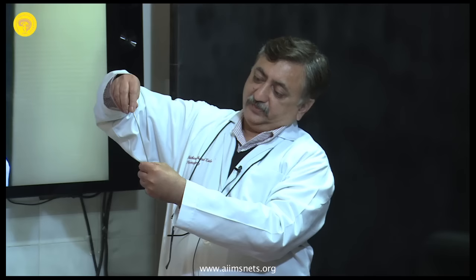That's the joint. So even if you don't distract it, because it's difficult to distract, what you can do is drill away some part of the facet here. The moment you drill a little bit, or even nibble it away with an upcutting instrument, you'll be able to see the joint, you'll be able to see the facet below. And then your anatomy will be absolutely clear. And the same relations hold true.